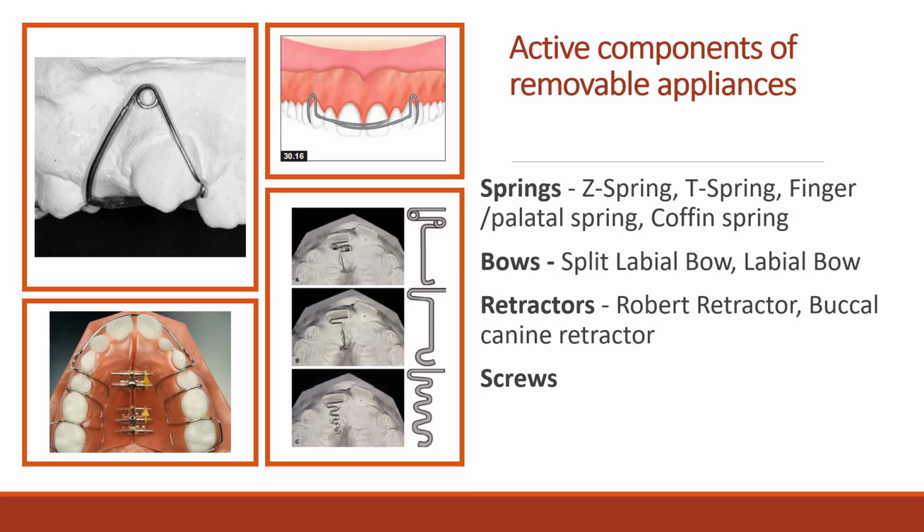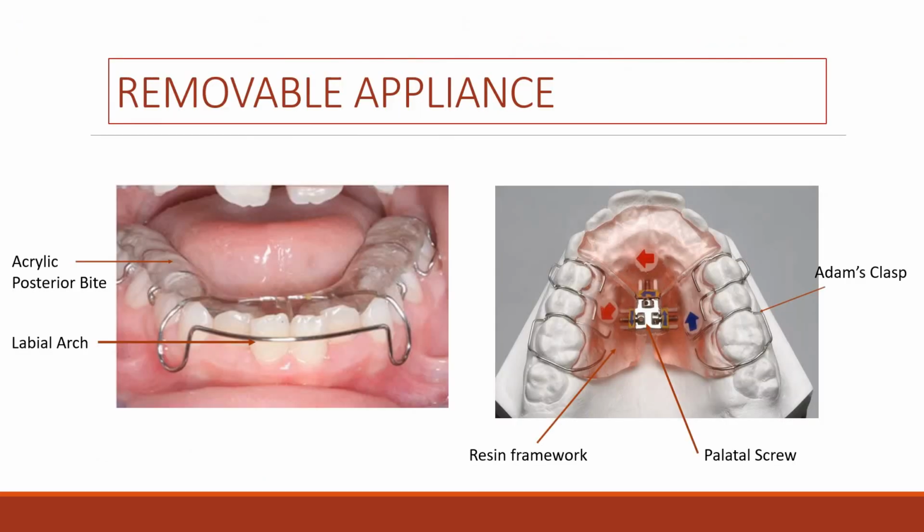A retentive appliance is also easier for the patient to wear and therefore optimizes patient compliance. Anchorage for a removable appliance is provided from either an intraoral or extraoral source. Intraoral anchorage comes primarily from the palate and dentition of the same dental arch, intramaxillary, whilst extraoral anchorage is from headgear attached to the appliances.